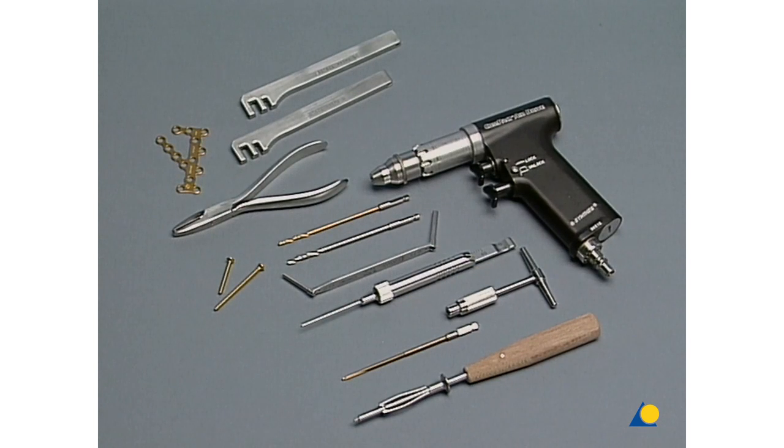For the fixation, we use the compact air drive with quick coupling with the 2.5 and 3.5-millimeter drill bits, and the corresponding drill guides. The depth gauge. 3.5-millimeter Cortex screws, about 30 to 50 millimeters in length. And a calcaneus plate, which is adapted with the bending irons and bending pliers.